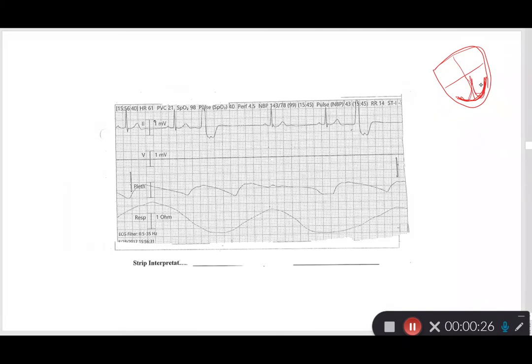Now, with a ventricular rhythm, you're going to get a very wide, bizarre-looking QRS complex. So if we just look at this wide QRS complex here, we're just going to note a few things. One, we can have a P wave that happens in the middle or right after that QRS complex. It's not something that we note in our title, but just be aware it is something that you could see, and that eventually we are going to get contraction of the atria because that signal is just going to be traveling backwards or the atria could be contracting by itself.